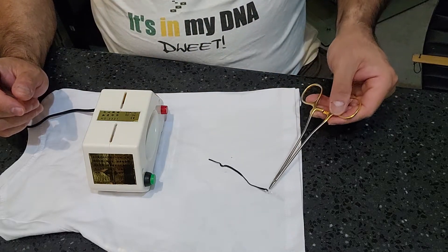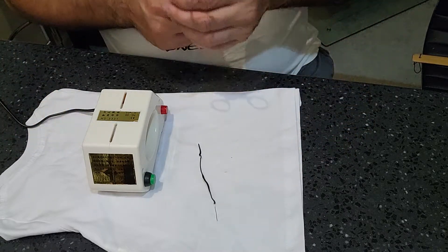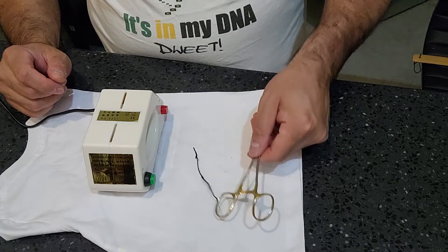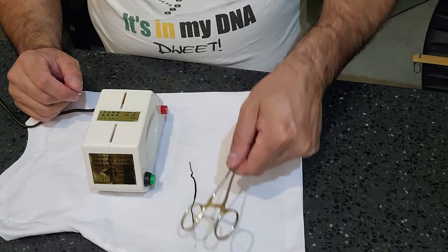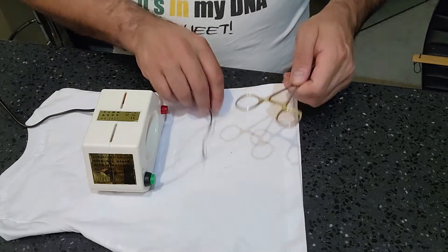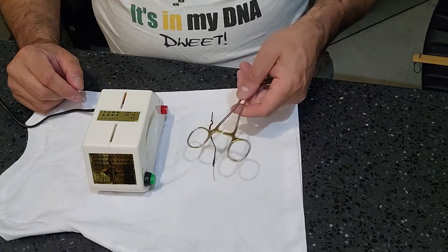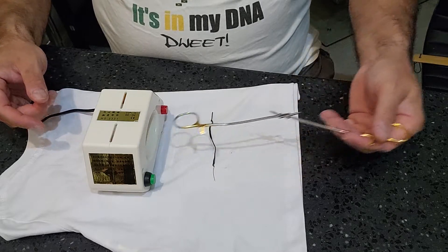You see that? I have a demagnetized tip — except for the handle, since I didn't get the handle all the way through. So I might have to pass this through again. Actually, the handle isn't that bad either — it's just a little magnetized. So I would probably have to open this instrument up and pass it through.